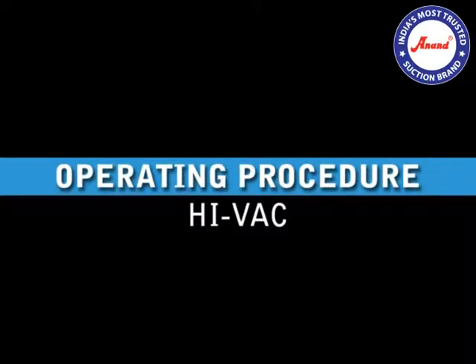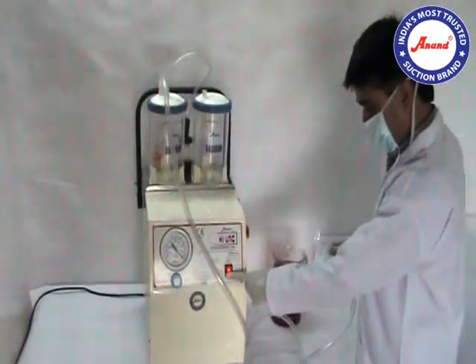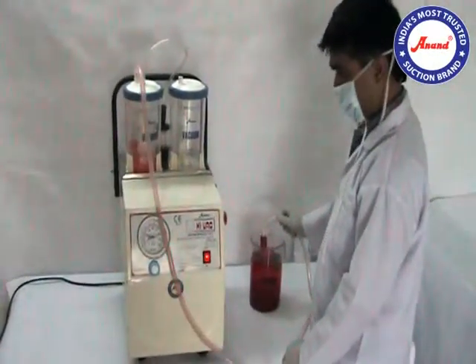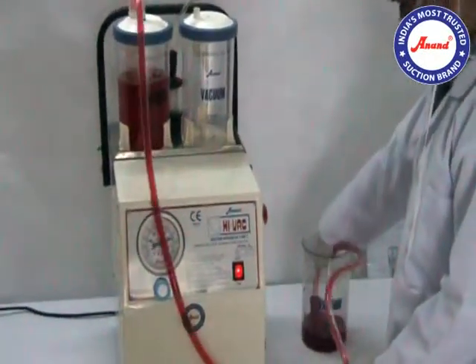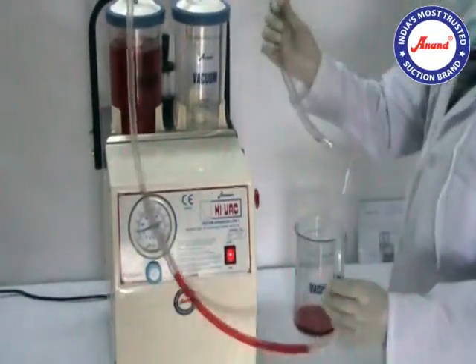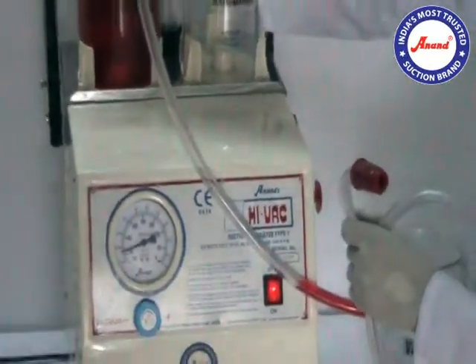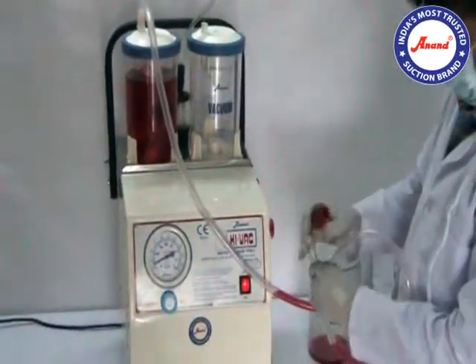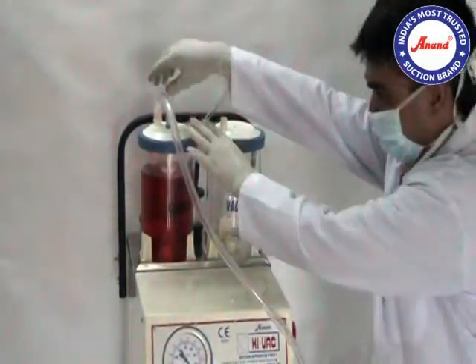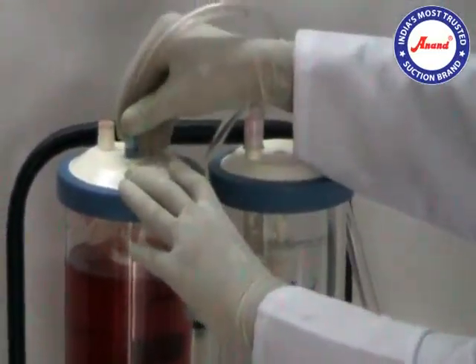Operating procedure of Hivac: Ensure that the jar is not filled more than three-fourths. Once the mechanical overflow cutoff device is activated, switch off the unit and replace the filter tube and patient tube to the other jar.